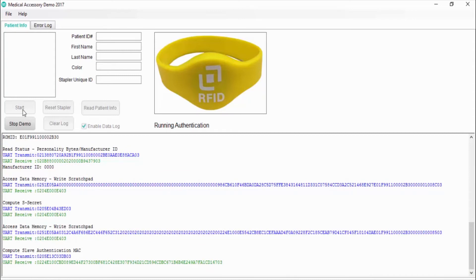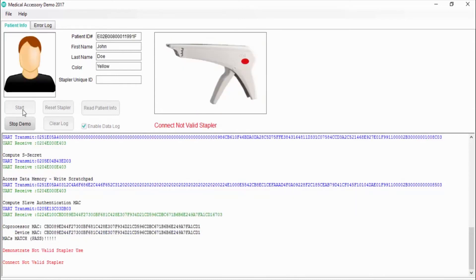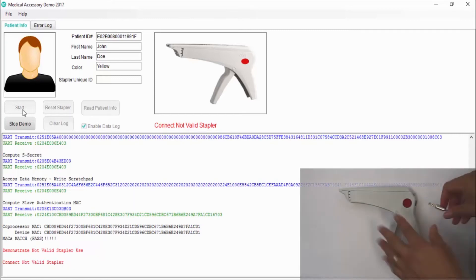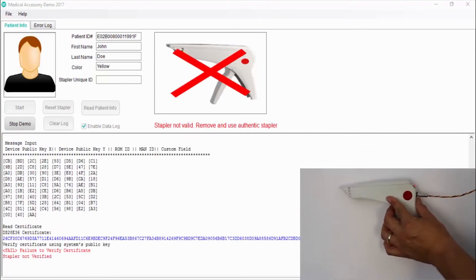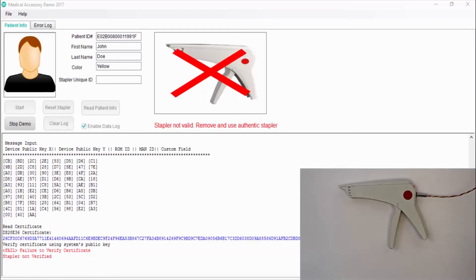Now let's demonstrate the scenario when the medical accessory is not authorized by the manufacturer. Using the OneWire to USB adapter, I connect the stapler with the red label that represents the unauthorized accessory. To pass authentication, the host will verify the ECDSA certificate that is stored in the DS28E36. This is accomplished by reading out the stored certificate along with additional information necessary to verify the certificate with a master site ECDSA verification operation. The DS28E36 in the unauthorized accessory does not have the correct certificate. The host performs the certificate verification on the device, and in this case it is not authentic, so the software doesn't allow use of the stapler.